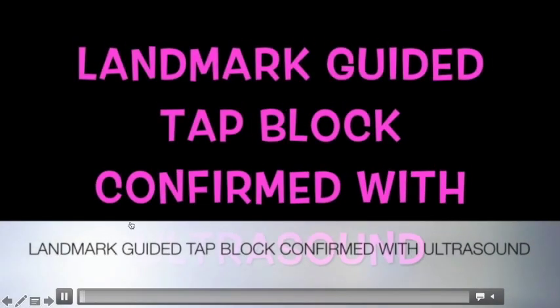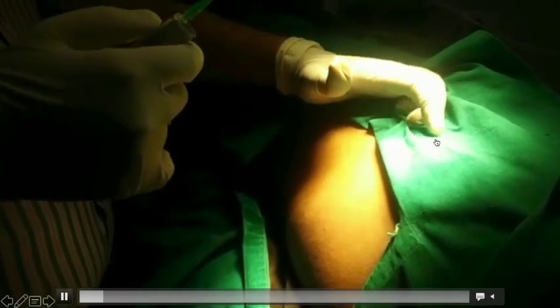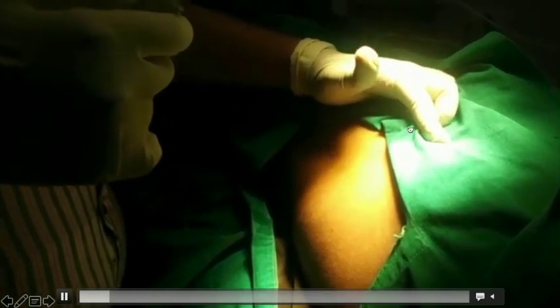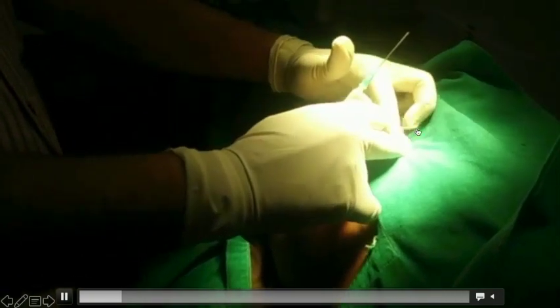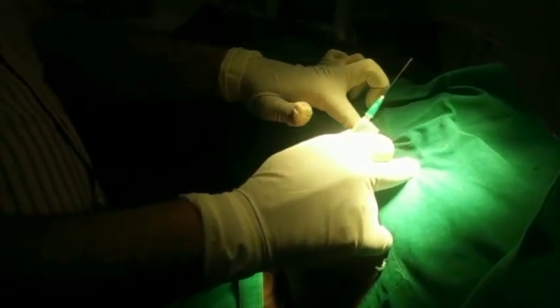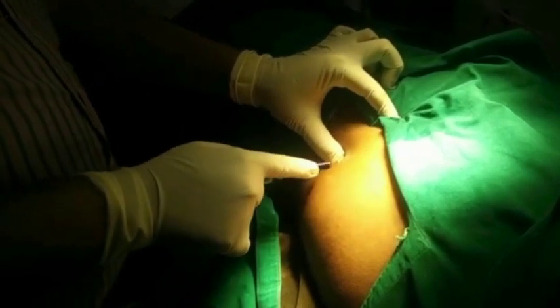So how to give a lower TAP block? This is very simple. This is landmark guided TAP block. This is a post LSCS patient. This is the anterior superior iliac spine, which I am palpating. I will go 3 finger or 5 centimeter cranial, then 5 centimeter lateral, and that is my needle insertion point.